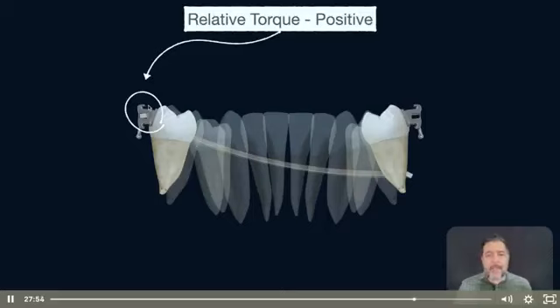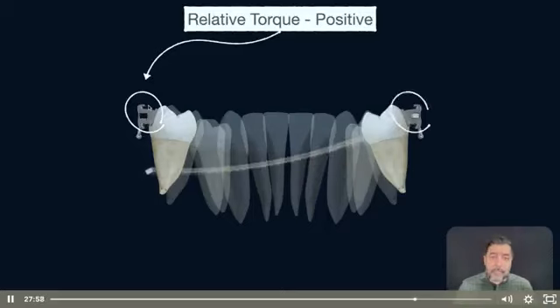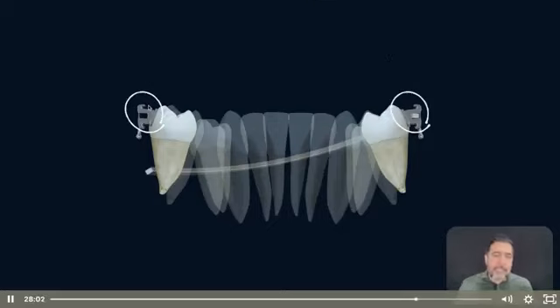I'm going to come back to this point in the next class, but here is important for us to see. Same thing is going to happen in the other side. And then when we apply the torque in just one side, we have a different way to see that.